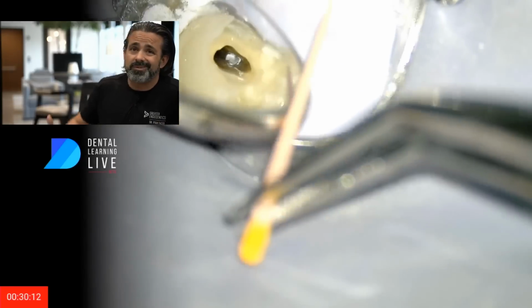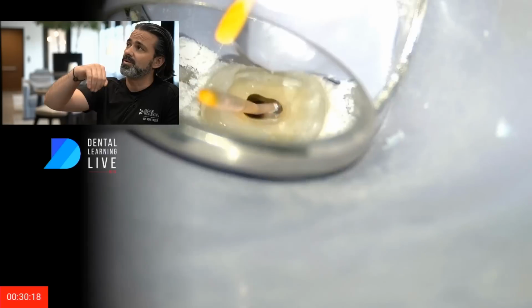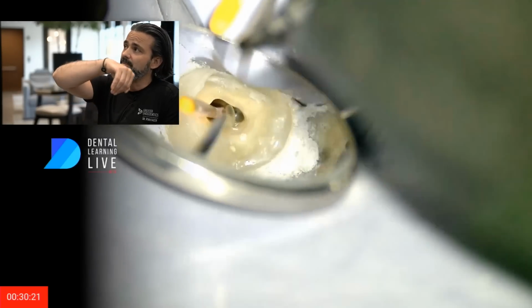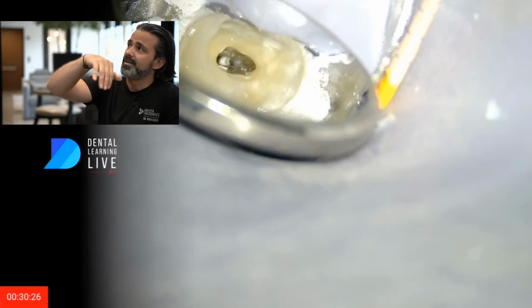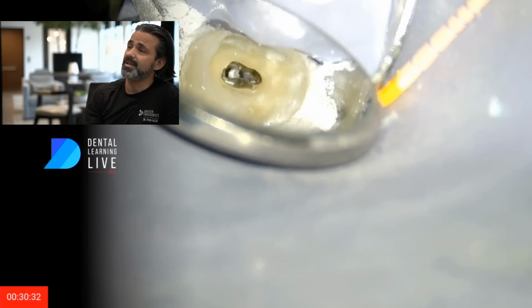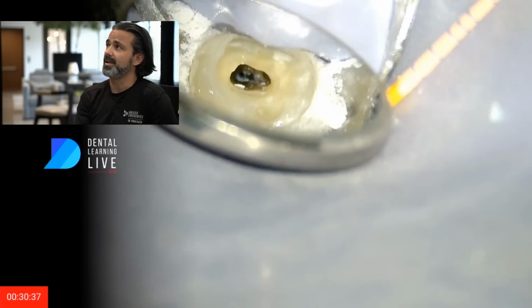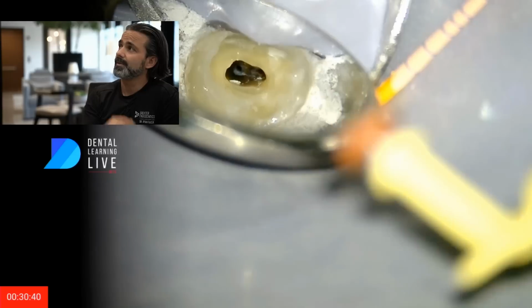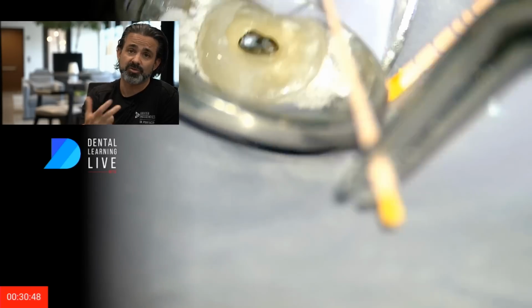Okay, so lingual again first because it's the most difficult to see, and I want to make sure I don't bend my cones and I can get them into place. So I put it in the lingual and then I'm activating it, kind of like a modified continuous wave, and just pushing on it, and clearly that heated element is binding really high. I am using BC sealer in this, and now I'm going to do the buckle. There we go, same technique. So I inject, and I'm going to place the buckle.